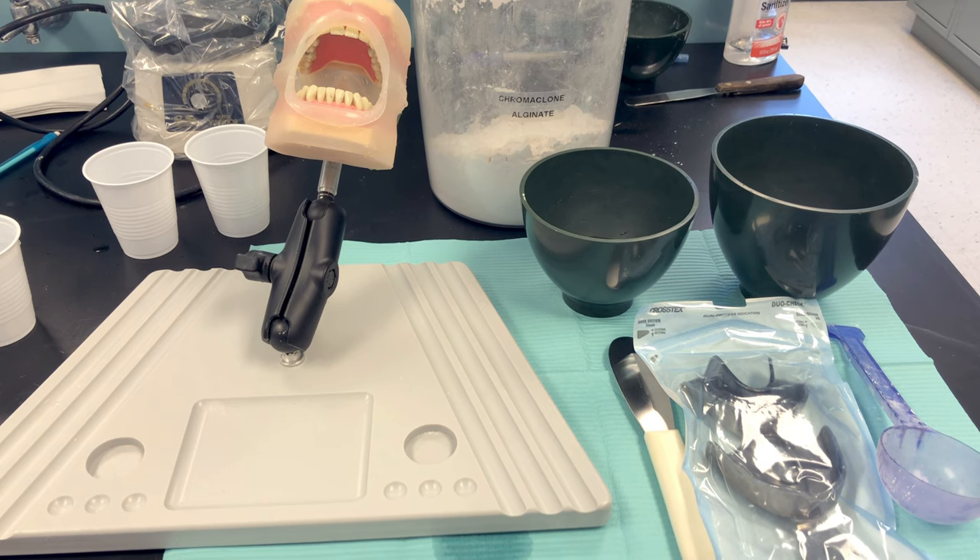Hi everyone, this video will show you how to mix, load, and place alginate. My demonstration will use a mannequin, but in practice I find it easier to take on a real patient. There are a lot of steps involved.